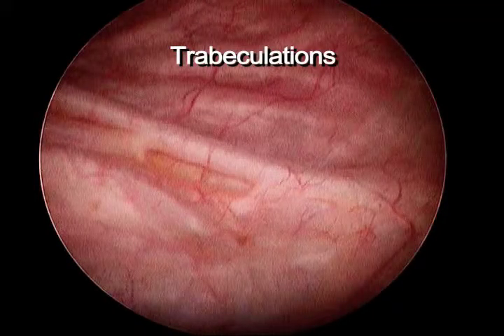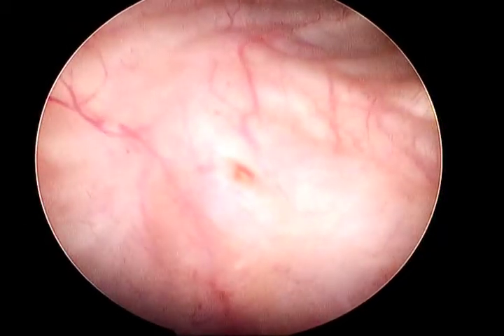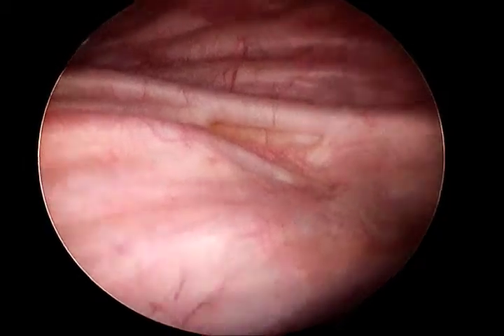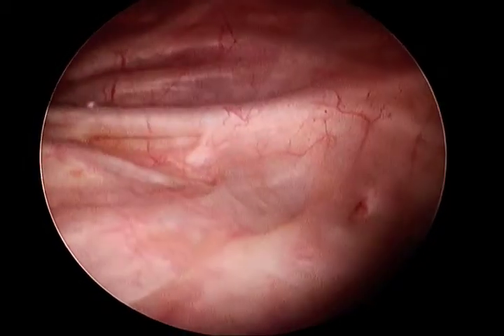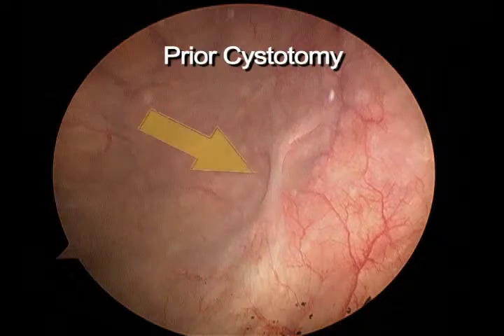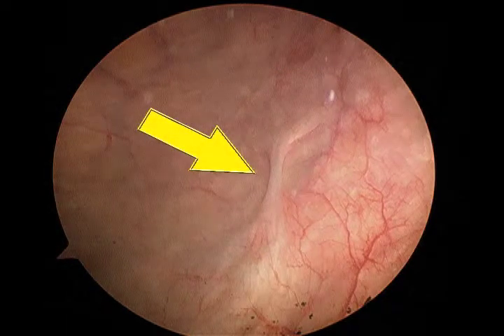Hypertrophied detrusor muscle within the bladder is referred to as trabeculations. This oftentimes can be seen in patients who have an overactive bladder. It can also be seen in patients with outlet obstruction. Occasionally scar tissue from prior cystotomies can also be seen, as shown here.